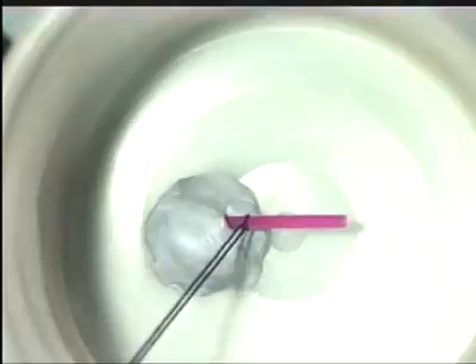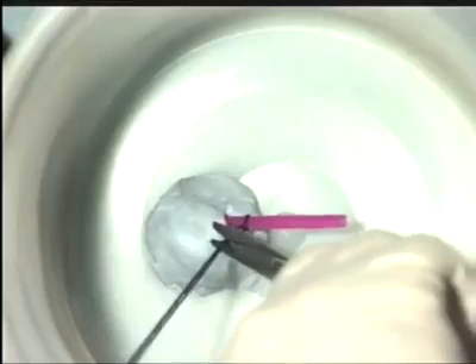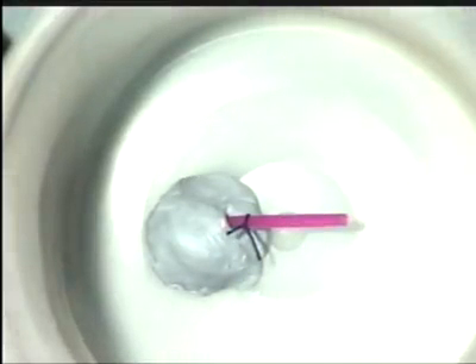Once complete, one is in a position to cut the suture. Ensure that no tension is actually placed on the vessel itself at any time.